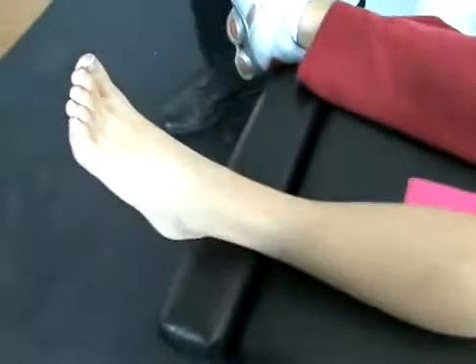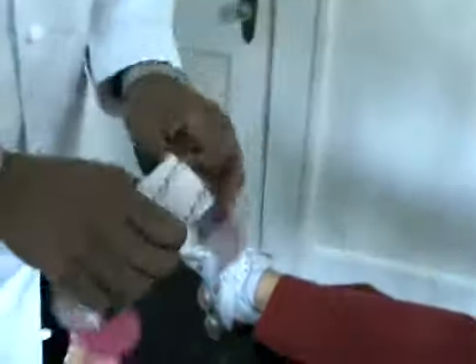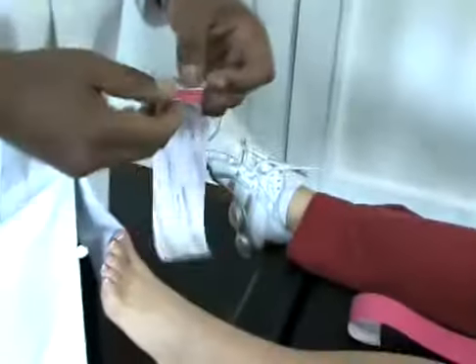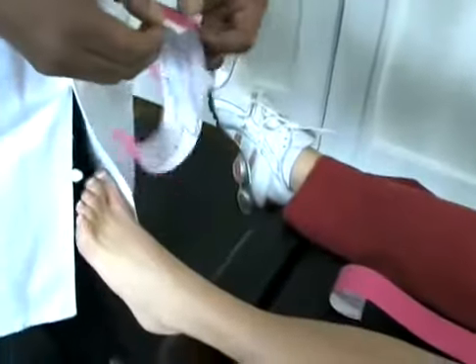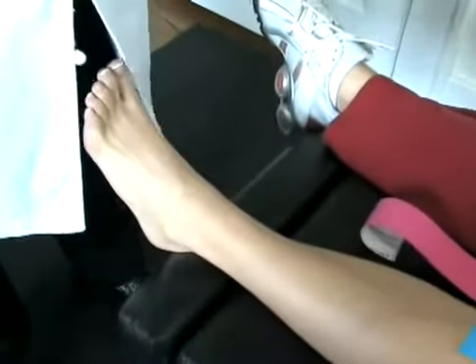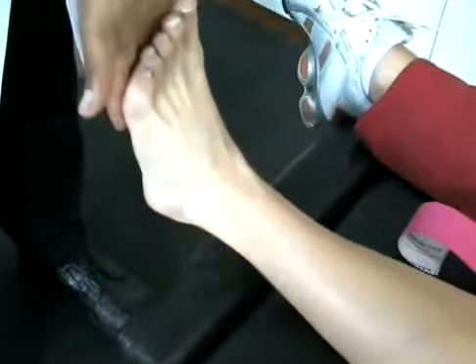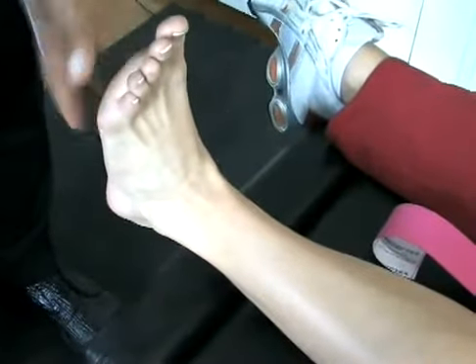We've gone ahead and gotten our Kinesio Tape ready, so we're going to go ahead and apply it. Let's go ahead and hold your foot right there.